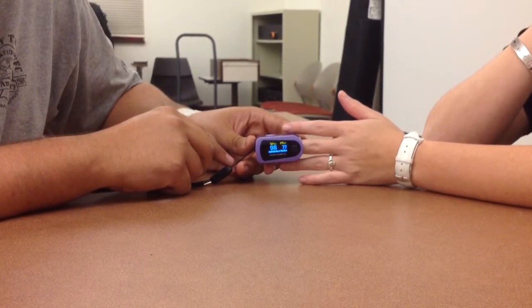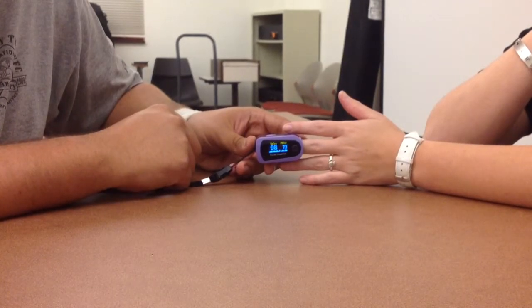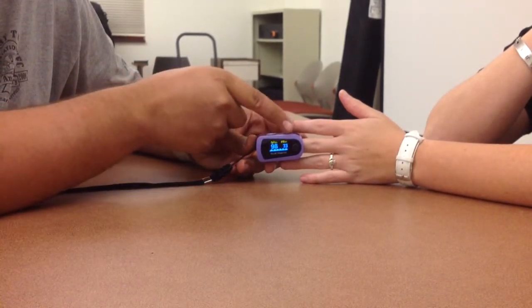The SpO2 is the larger number on the front of the screen. Most pulse oxes will also show you a heart rate, which will commonly be the smaller number on the screen.